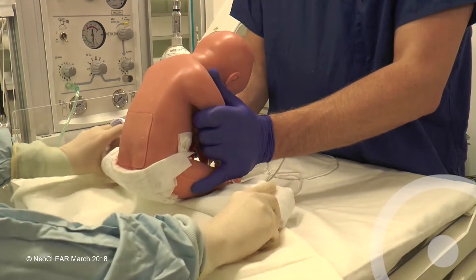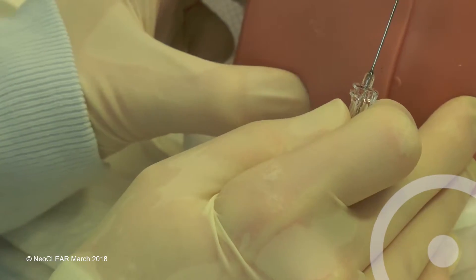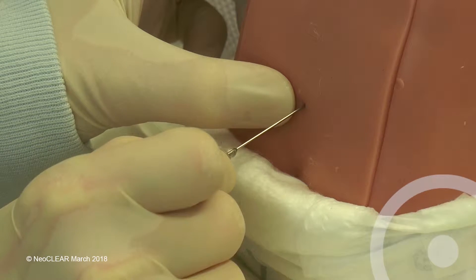Place the baby on a sterile drape and remove the outer gloves. With the baby in the sitting position, insert the needle angled towards the umbilicus with the bevel facing to the infant's side.